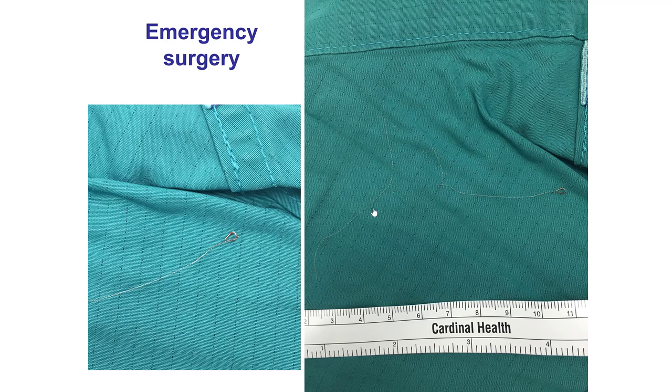The patient underwent successful surgery with bypass. The wire was removed, and we can see that the wire had apparently come back and tied a knot into the proximal portion of the stent and then also unraveled. This makes retrieval very difficult — every time you try to grasp these parts with a snare, you are only creating more and more pieces of wire coming out.